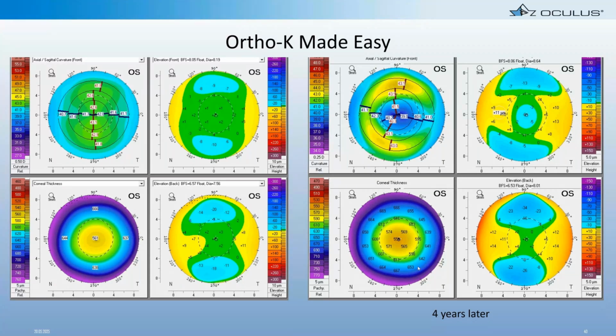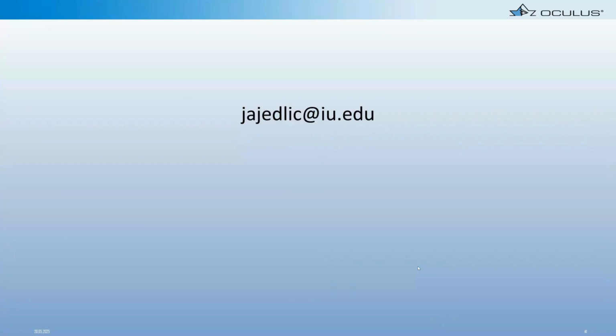So that brings us to a close for the presentation. If you have any questions, you're free to contact me at the email address listed, and I'm happy to take more questions. But again, just to summarize, the Pentacam really, as opposed to other Placido disc topographers, the key highlights to me are the amount of true data, the non-tear layer dependence, and then all the integrated information, as well as screening our patients for those at risk before we begin the process.